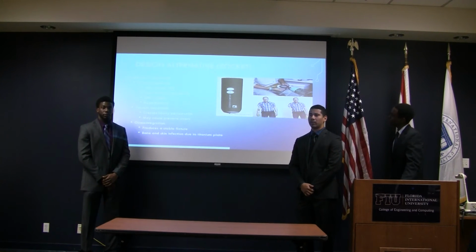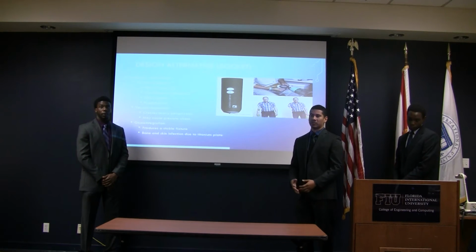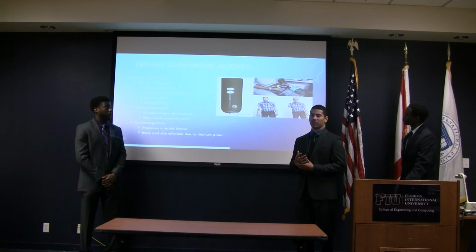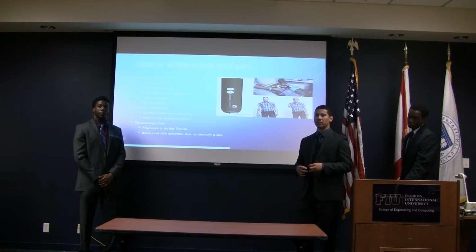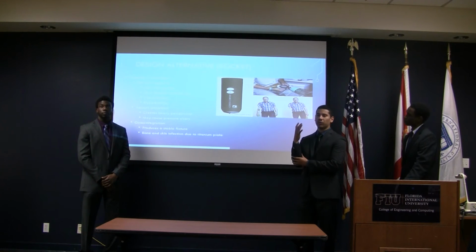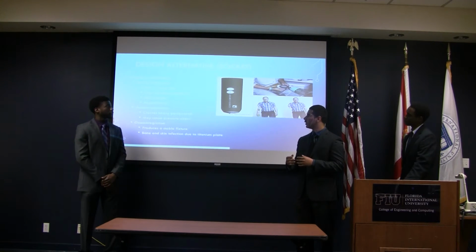The first design alternative that will be considered is the socket. The socket is known to be one of the most important parts of the prosthetic itself. A suitable socket that fits well over the residual limb will minimize discomfort and increase functionality. Examples of such attachments related to the socket include silicone suspension, locking suspension, and osseointegration. Silicone suspension deals with rolling a silicone liner over the residual limb, creating a seal. From there, a pin will be connected to the socket, and then an attachment will be created between the socket and the prosthetic arm itself.